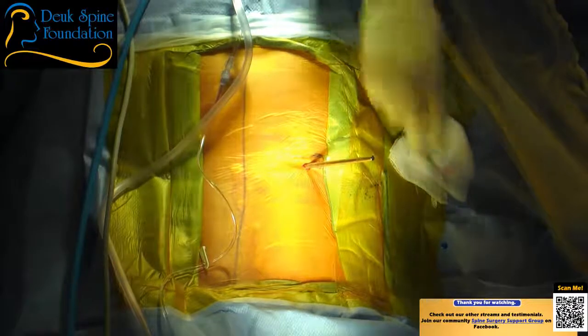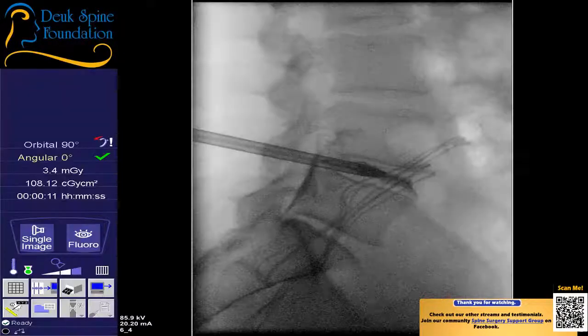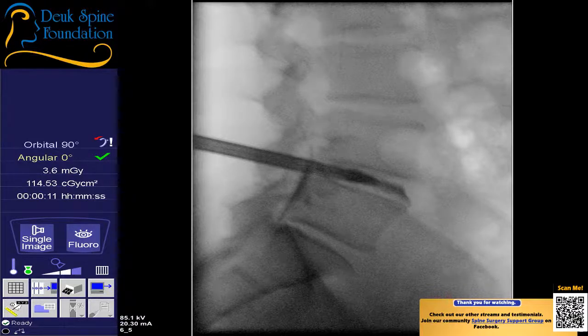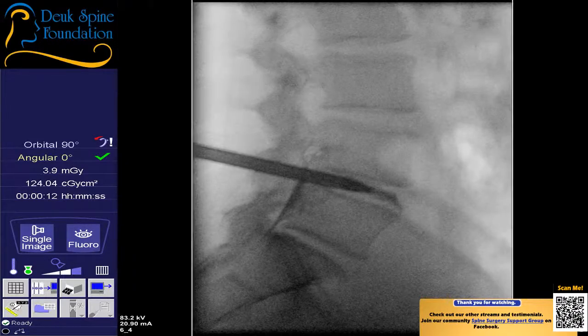Those squiggly lines are just the marker found inside the sponge so surgeons don't leave sponges in people — obviously we're not going to leave a sponge in anybody. We've passed through the foramen and gone right through the herniation and the annular tear. Every other spine surgery out there — micro discectomy, laminectomy, fusion, artificial disc — damages the spine to get to the herniated disc. This is the only surgery that doesn't.